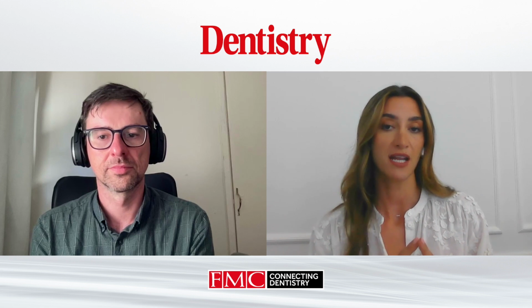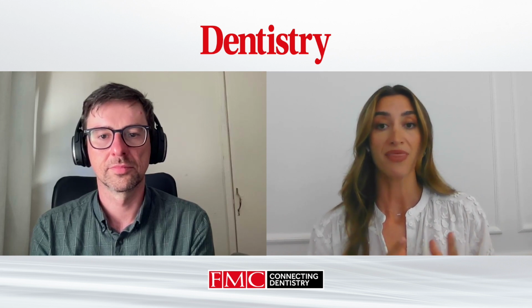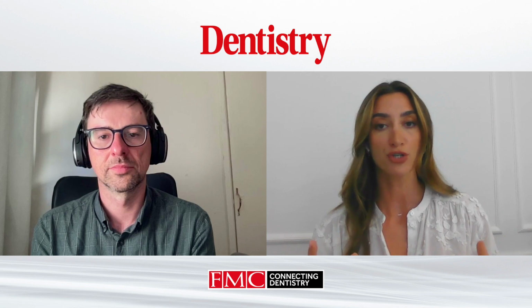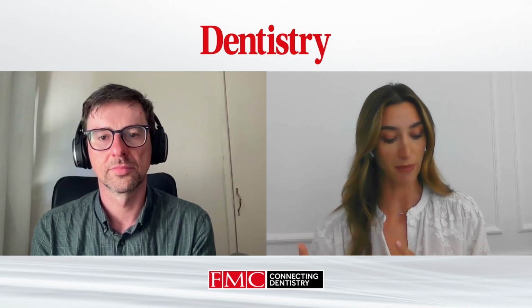and discuss with them if there's any other areas that they feel maybe need a little bit more fine tuning. And that would be a great time to maybe tweak or refine with some dermal filler or perhaps some toxin as well. So that's kind of a typical approach that our practitioners use when they're combining Emface with injectable treatments.